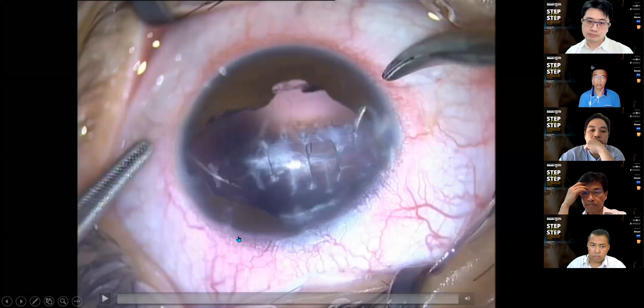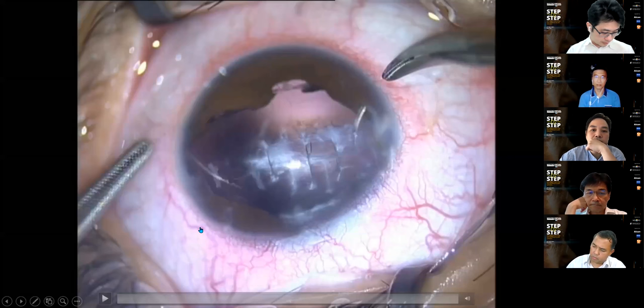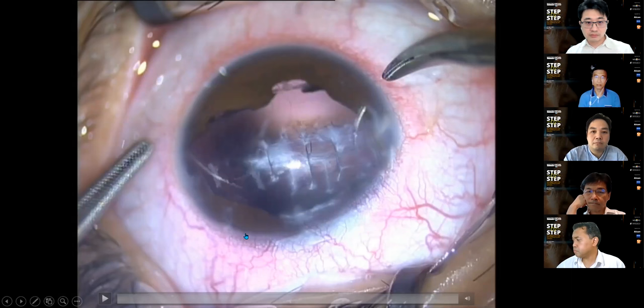What kind of IOL do you want to implant? This has to be scleral fixated. You cannot implant a sutured iris support IOL. And what kind of IOL? Because of so much iris tissue lost, I decided to put in an iris diaphragm IOL. In the market right now, there is no aniridia IOL that can be folded or injected. All are PMMA made IOLs. Therefore, the wound has to be big, at least 11 millimeter. And therefore, I have to make a rather big peritomy.